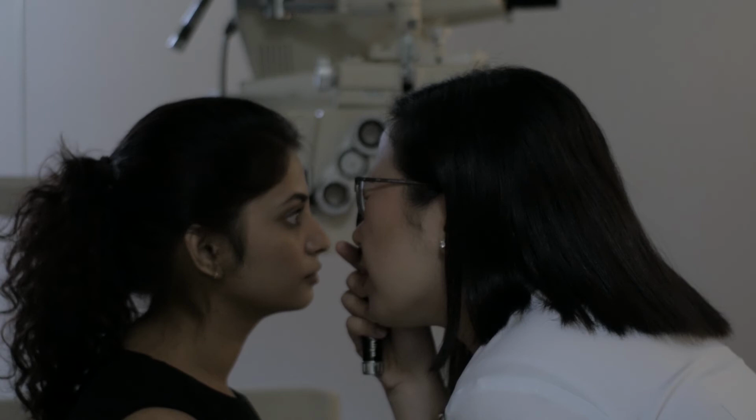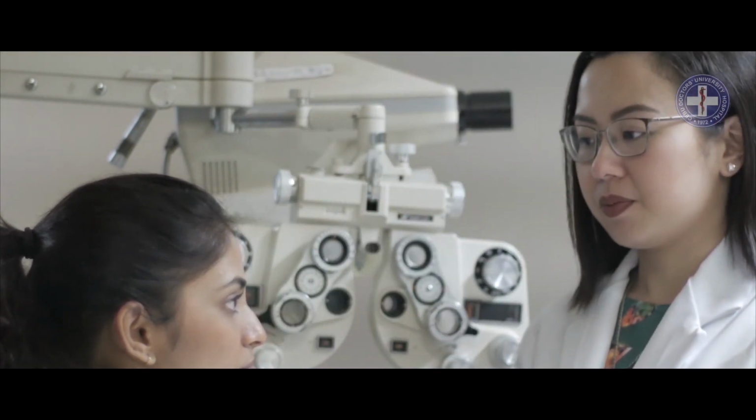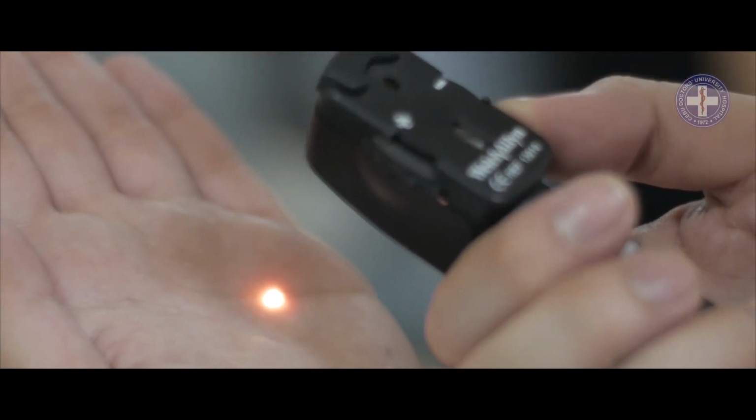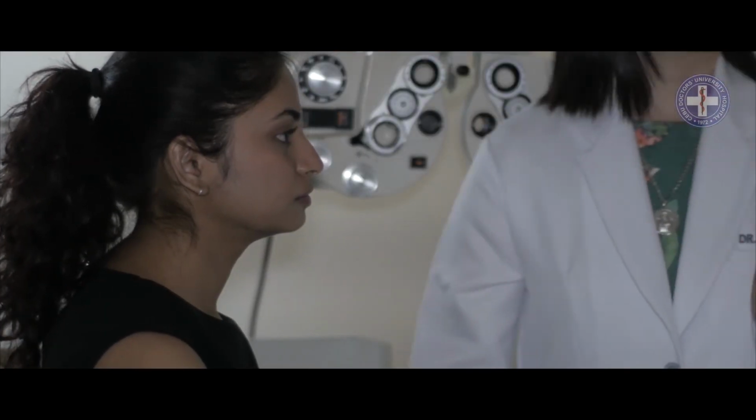To begin, dim or darken the room to increase mydriasis. Instruct the patient to look away to avoid miosis. Switch the ophthalmoscope light to white light and turn the lens disc to 0 diopters, which is a lens that will neither converge nor diverge light rays.